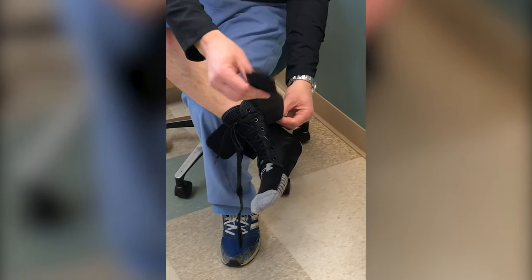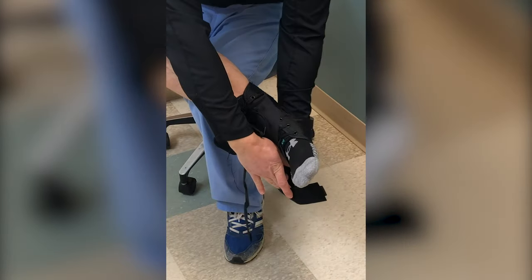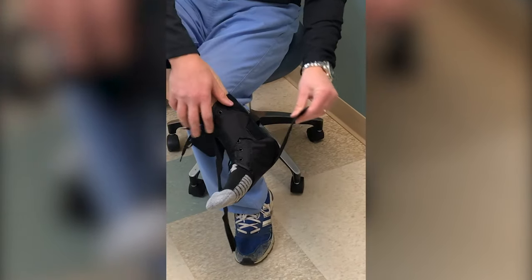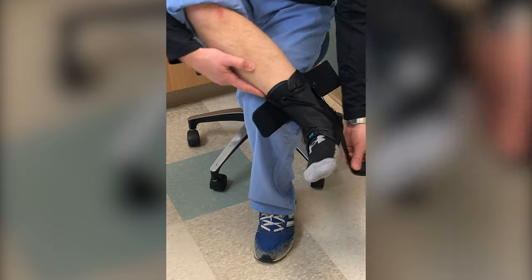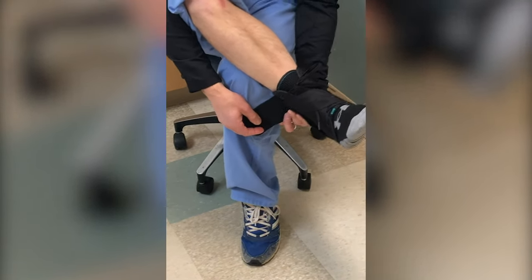Now you're going to take each strap — it doesn't matter which one you start with — but you're going to cross the foot and come up right at the heel to the side. Then do the same with the other, crossing right under the heel and up the side.